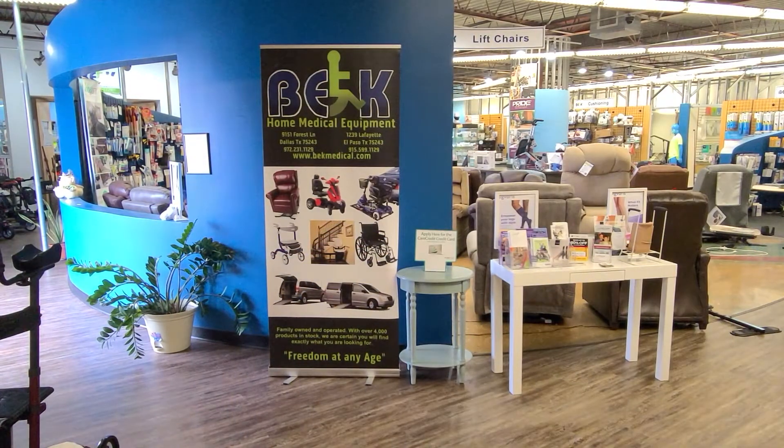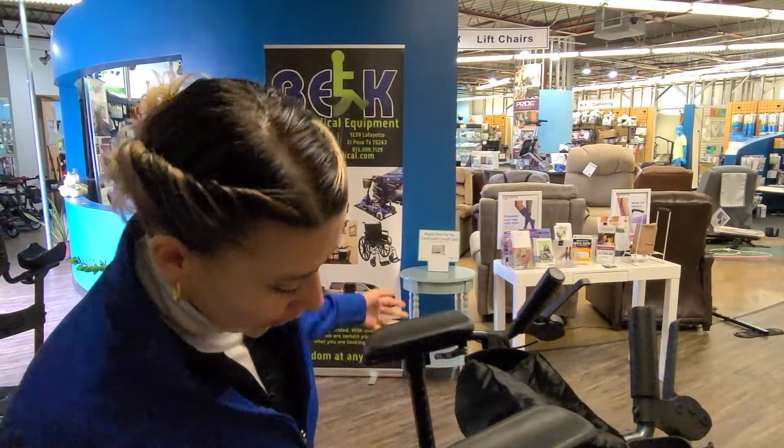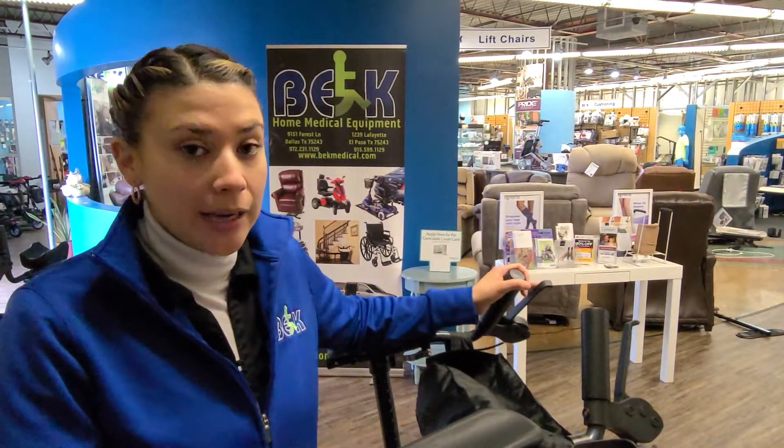Hey! Bianca with BEK here in Dallas. I just wanted to show you three different types of upwalkers, or upright walkers, whatever you call them, that we carry. The first one, our most popular, is going to be the actual Upwalker.